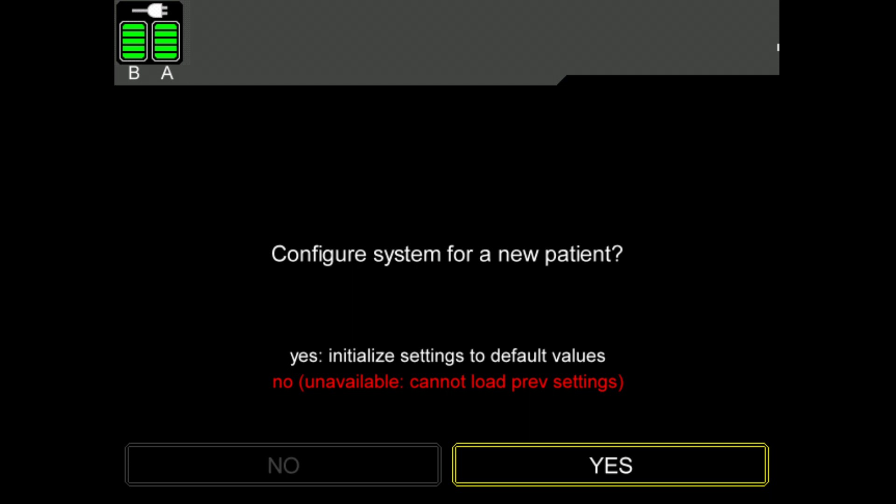If there has been a data loss or corruption of previous data, the operator will not be allowed to restore previously used values. The no option will be unavailable. The operator will have to reconfigure the system manually to return to the previously used settings.